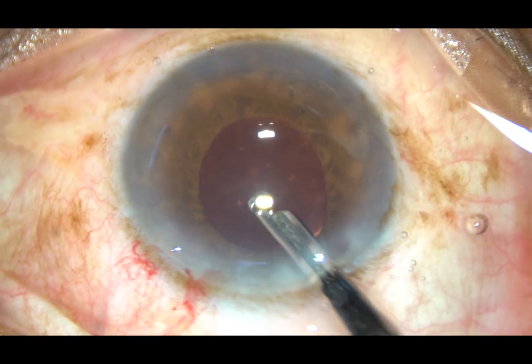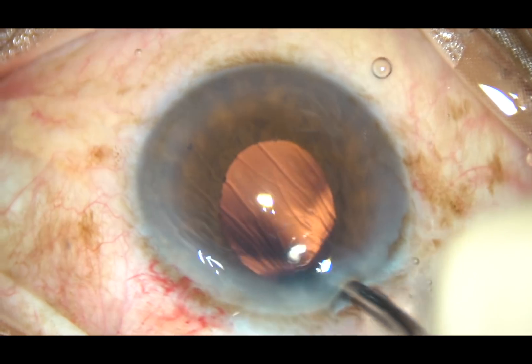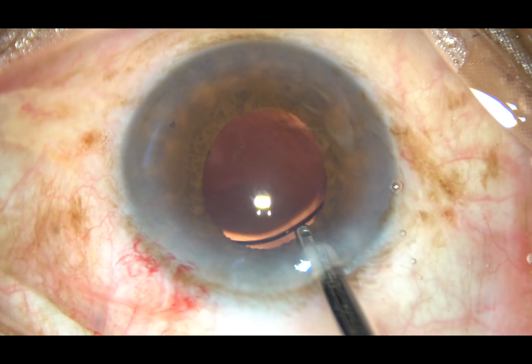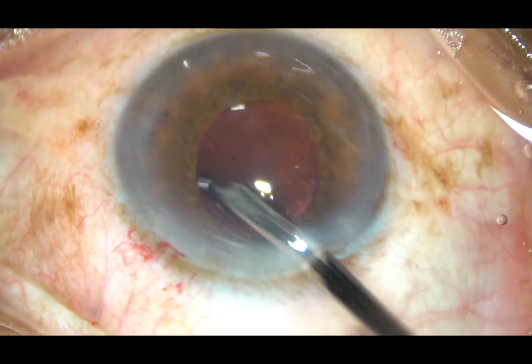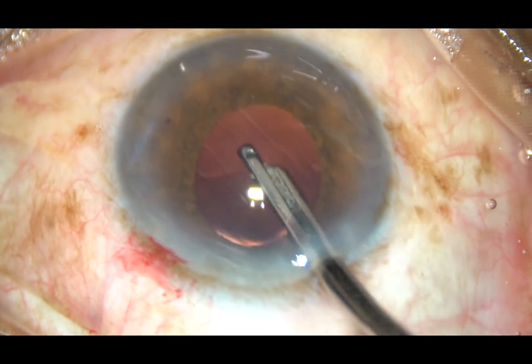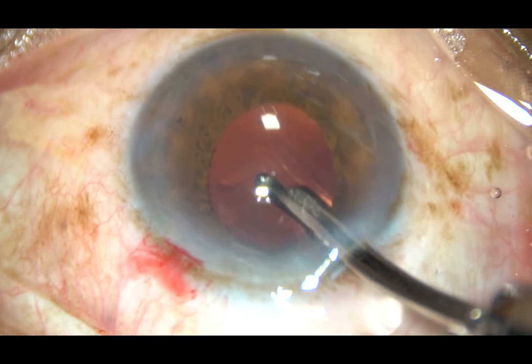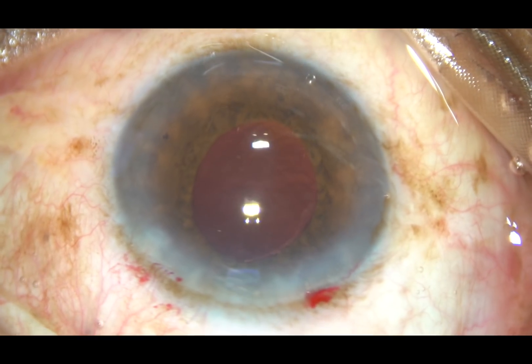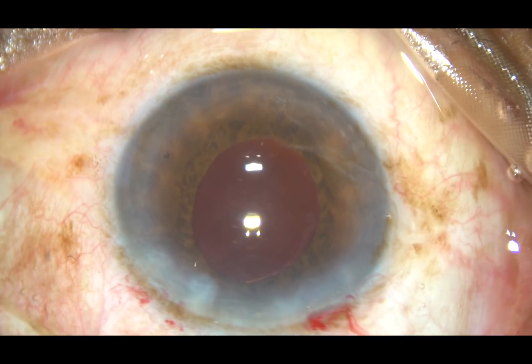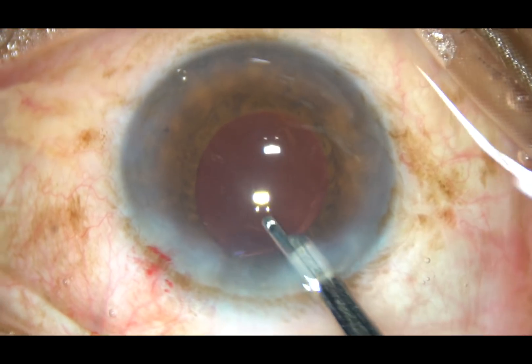This removal of viscoelastic substance should be very meticulous. This is a stage which is not as glamorous as management of the nucleus with ultrasonic energy — this is just irrigation and aspiration of the viscoelastic substance. But it is very important. Unless we spend some time cleaning the viscoelastic substance meticulously, what will happen is the intraocular pressure will be very high the next morning and the patient will not feel comfortable at all.